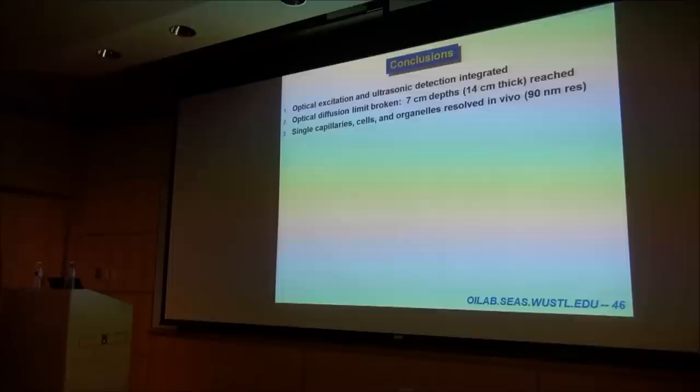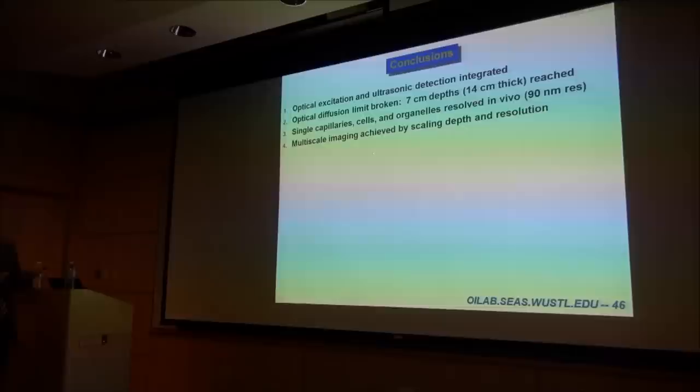We've demonstrated that single capillaries, cells, and organelles can be imaged. And we demonstrated the best resolution at 90 nanometers. That's a super resolution, really breaking through the diffraction limit. Multi-scale imaging comes from scaling the depth and resolution. A lot of times, you just have to scale the ultrasound frequency. And this scalability applies to ultrasound imaging as well.